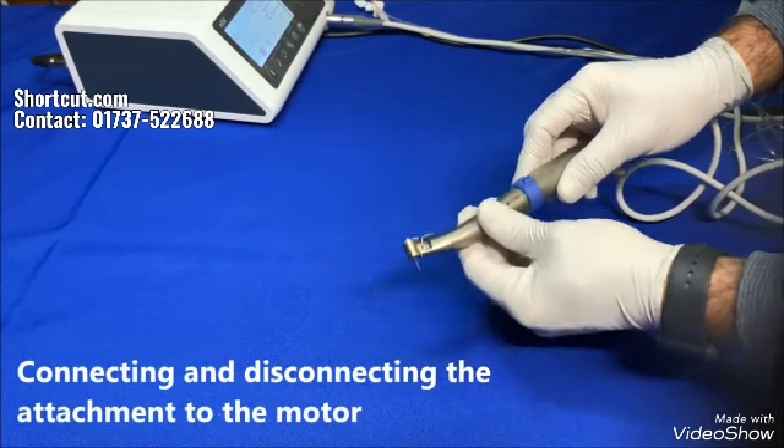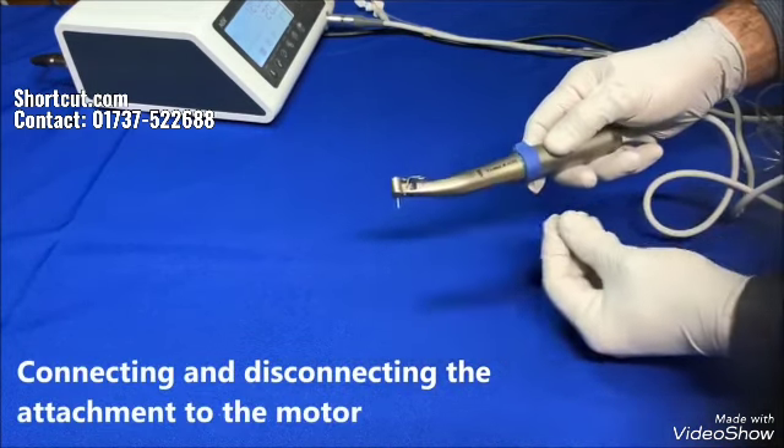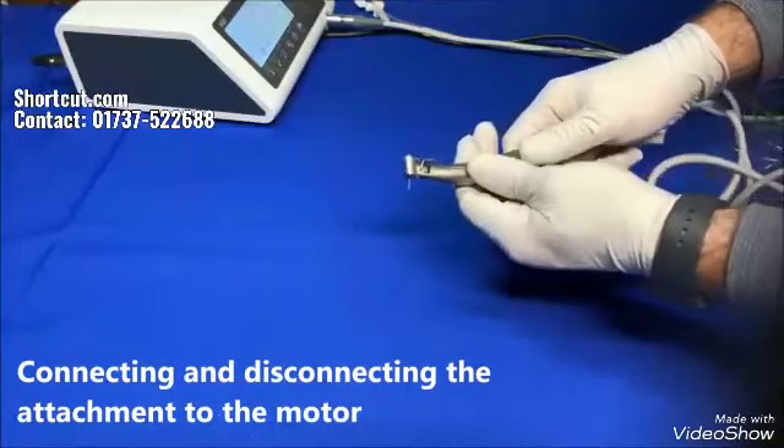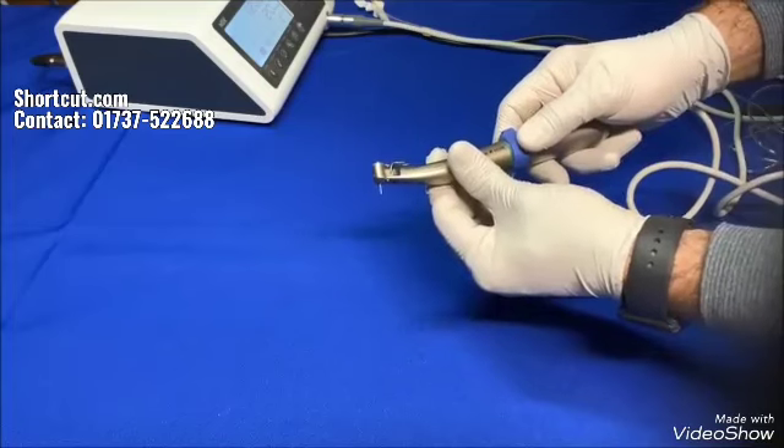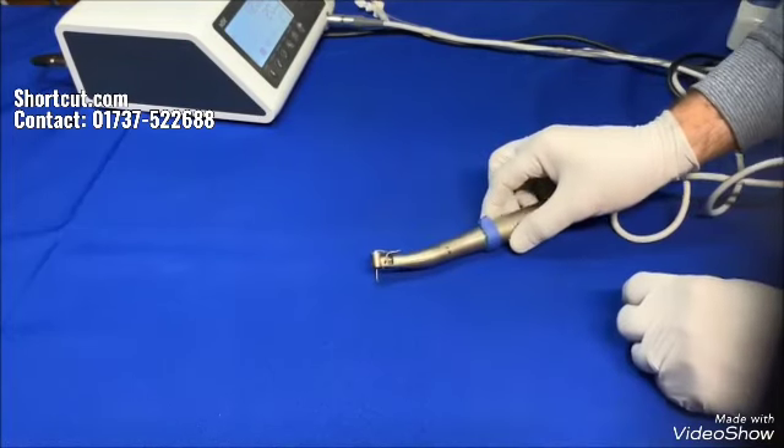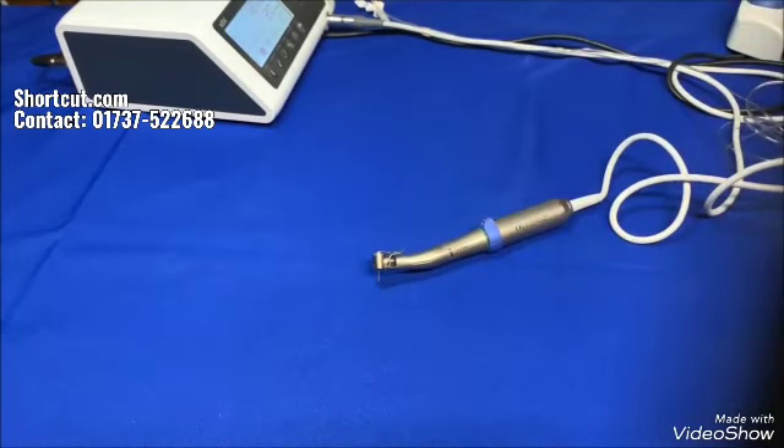Insert the attachment into the motor and then twist till it clicks. Detach it by pulling it out. Optic and non-optic models have different locking concepts, but they work the same way as far as connecting and disconnecting — they need to be locked into the motor and simply pulled out as described.